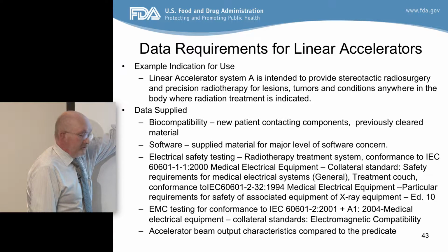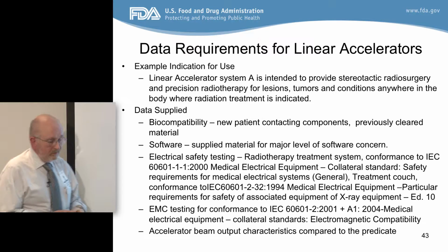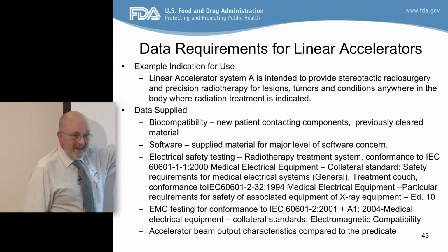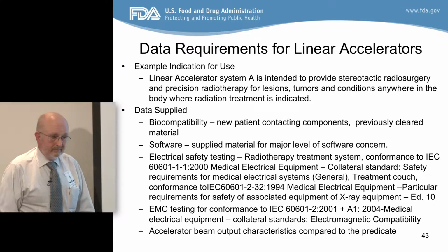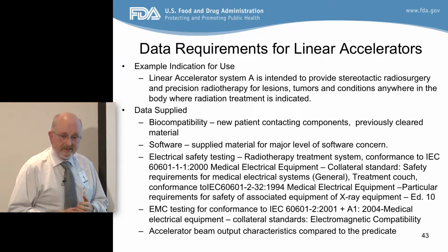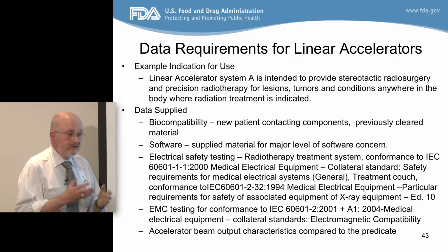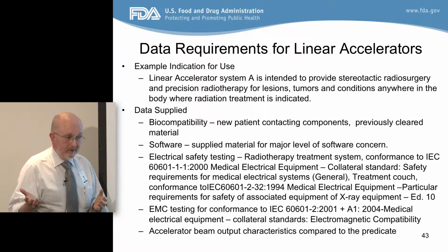And if somebody was to say that we have this general indication and we can treat essential tremor, that last phrase will generate some interest in the Division of Radiological Health, the nuclear medicine and radiation therapy branch.